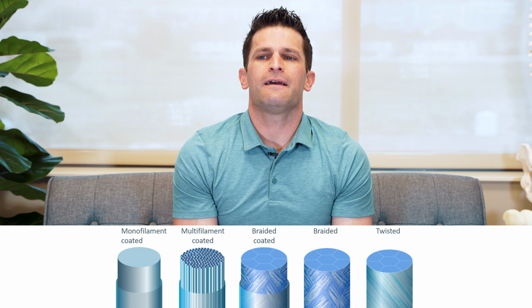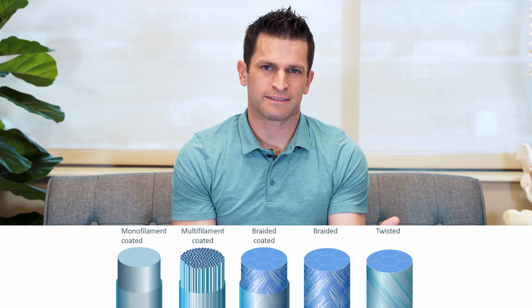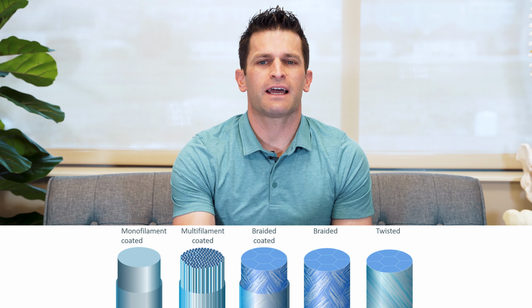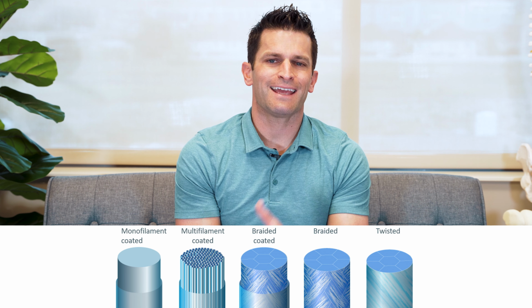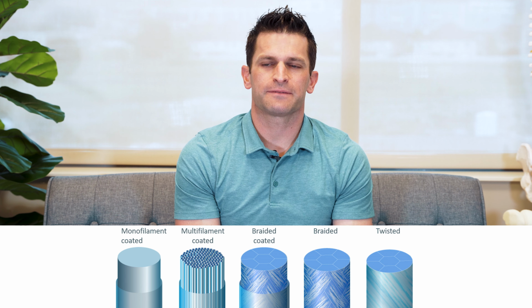When we close wounds, we usually use a deeper suture under the skin that is braided and absorbs. And it absorbs over the course of a few weeks. So let's say we're doing a lumbar fusion or maybe we're doing a cervical disc replacement. There's some layers under the skin that we close with absorbable suture. And again, the time frame for the absorption is a few weeks.